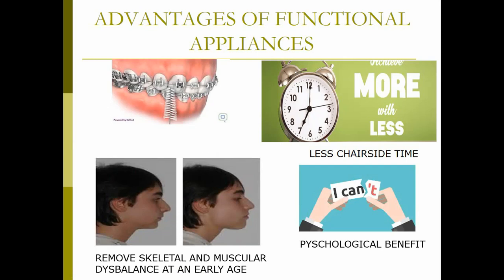And of course, you can easily remove the appliance and clean it, unlike fixed appliances, such as braces, where maintaining oral hygiene becomes a difficult job. Of course, with fixed functional appliances this drawback will be there as well, but compliance will not be required.